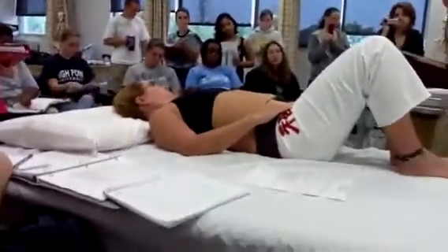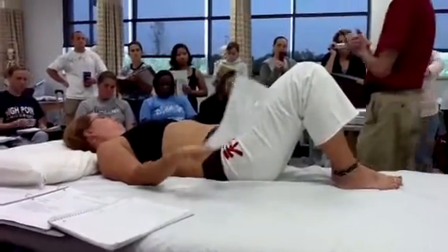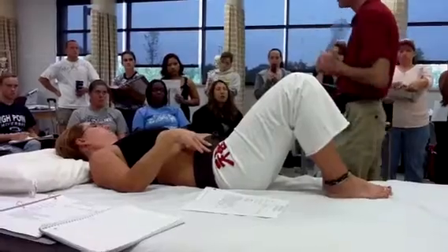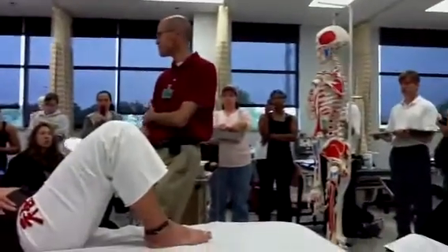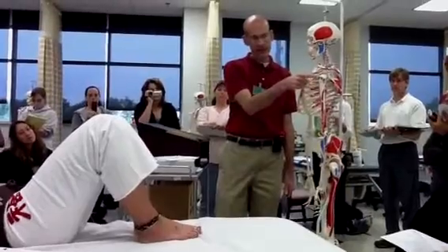Then number 4, you're going to accurately palpate the appropriate bony landmarks on a skeleton and on a subject. So I'll say to you, or Chase will say to you, all right, what are you going to use to line up the axis of your goniometer? And you're going to say, greater tubercle of the humerus. Okay, palpate that over here. So you'll come palpate that on the skeleton.